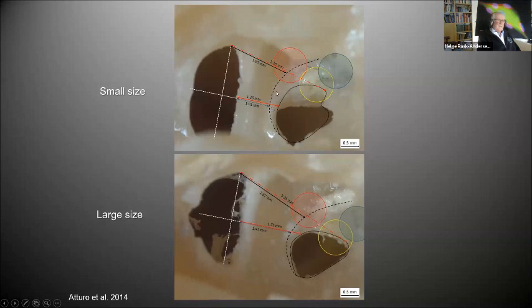And the reason why this is so difficult to do atraumatically with an inferior cochleostomy is because some ears are smaller than others, and in the smaller cochleas, which is difficult to know from the X-ray, you end up higher up with your inferior cochleostomy. So I think we should try to do the surgery through the round window. I guess you all do that already. So this was the end of the story from my side.